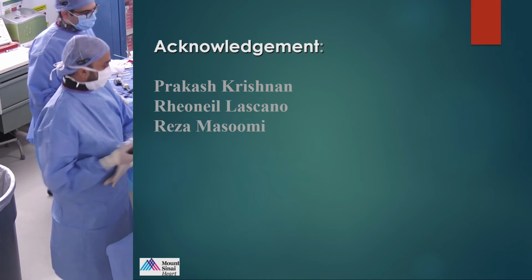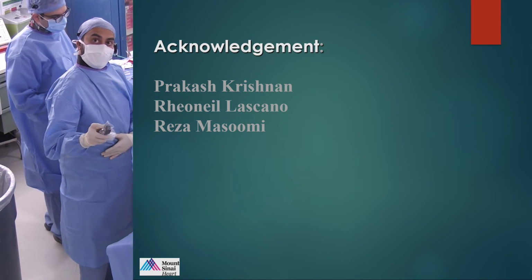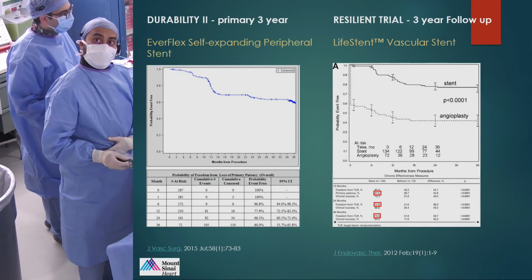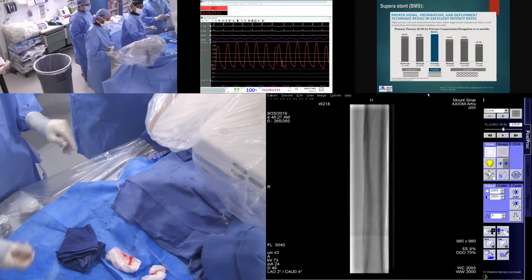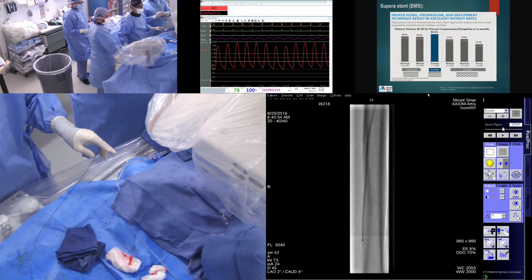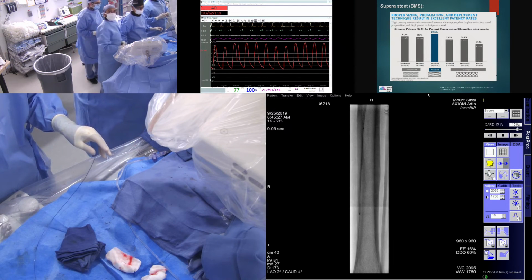Okay, so Ajit, I think that presentation is great because it goes over everything we talked about. In the meantime, let me show you what we've done. Go ahead with the scene minus two, please. So we did our balloon angioplasty, like you and I spoke, for four minutes.